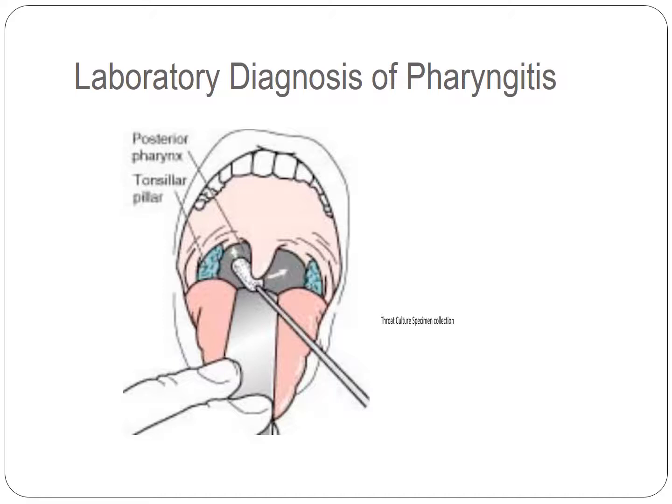You have to look for the spirochete Borrelia and the fusiform Fusobacterium necrophorum or other Fusobacteria together to be able to make the diagnosis. And that is the only time that the direct gram-stain smear from an upper respiratory secretion will be of value. Now, to differentiate bacterial pharyngitis due to streptococci from viral origin, a throat culture is therefore performed.